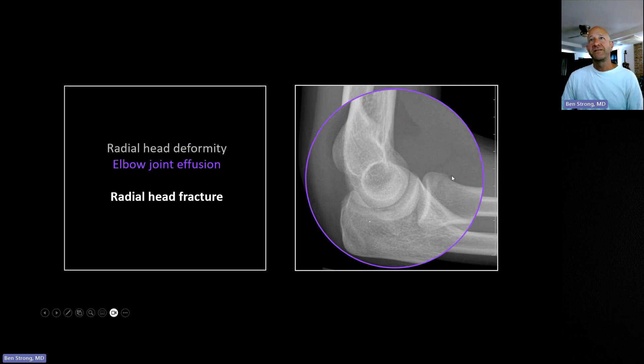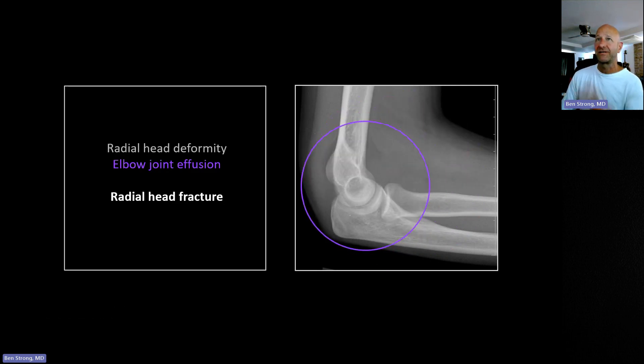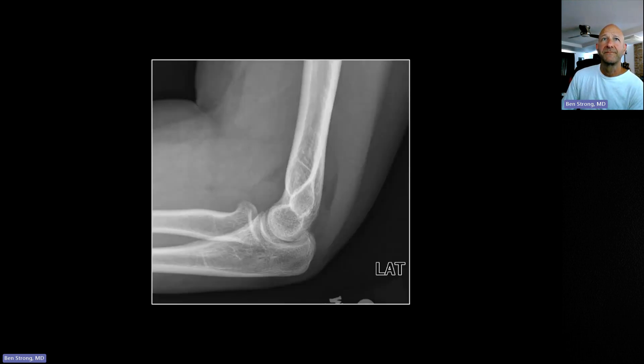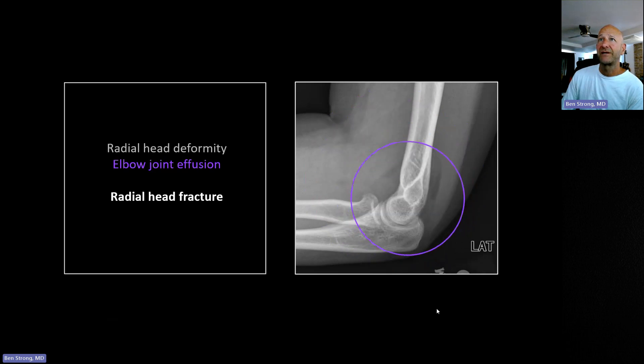This is a radial head fracture — there's just a tiny little step off; you might not even call that. But you've got this huge hemarthrosis, and in an adult you're going to call a hemarthrosis a suspected radial head fracture. In children, of course, it means a supracondylar fracture. Here's a better example where you can actually see the fracture clearly right there in the radial head, with the anterior fat pad sticking way out — a clear sail sign — and a big prominent posterior fat pad as well.